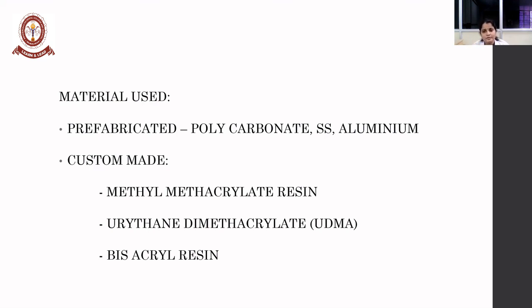Indirect technique means, before the patient comes, you will be making the temporary crown indirectly on the diagnostic cast, and then you will be adjusting it and cementing it in the patient's mouth. Direct-indirect technique means we have to take the diagnostic impression, and then make it in that cast itself, and then remove it. Then the putty index over the prepared cast is taken, and the material should be loaded in it, or a shell can also be used over the material.